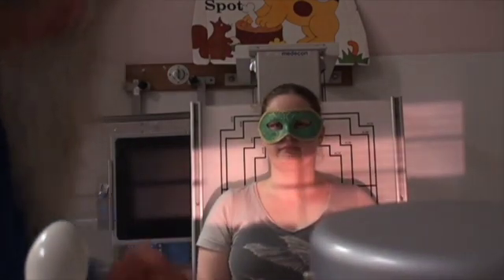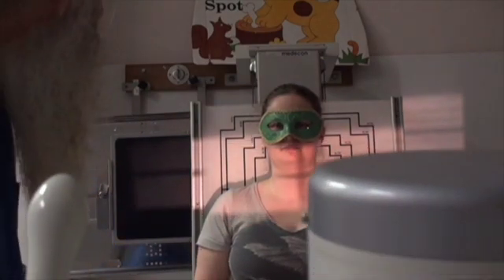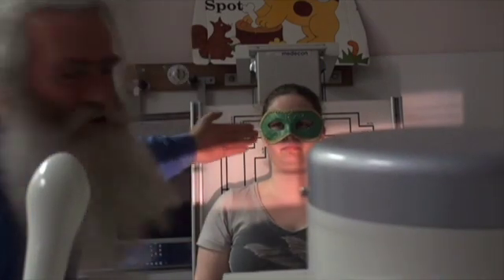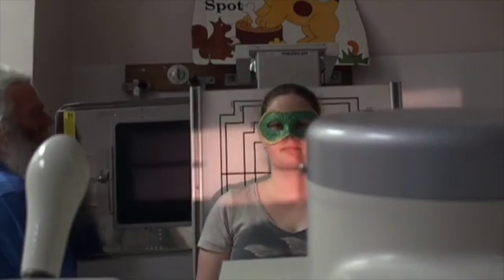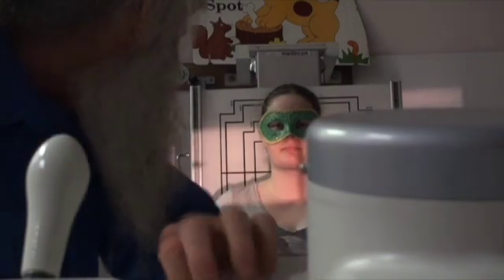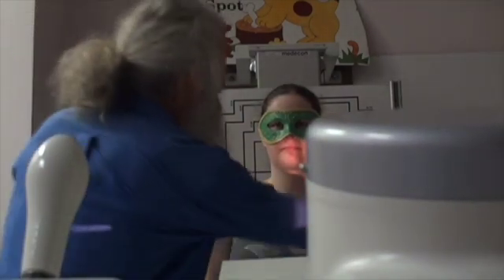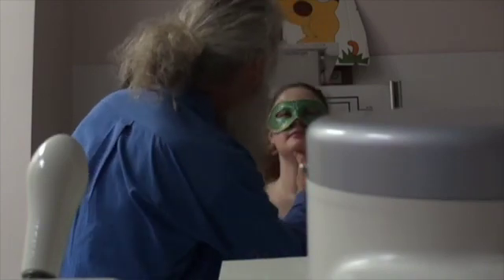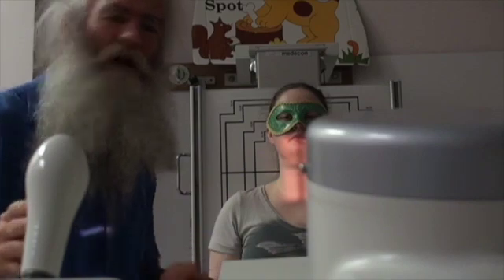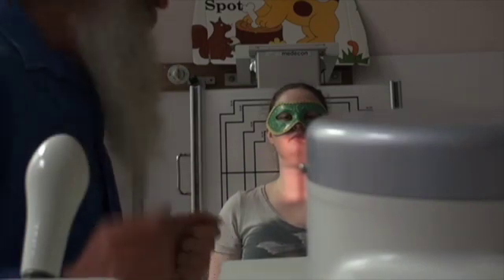The first view is the AP cervical spine. We go up about 15 degrees, turn the light on, and work out how much of the film we want to expose, then adjust the height of the machine to suit the patient. With my system, because the collimator is set, I move it so I can show the ear and then move my film up behind there. That's pretty much our first x-ray — that's our AP cervical.